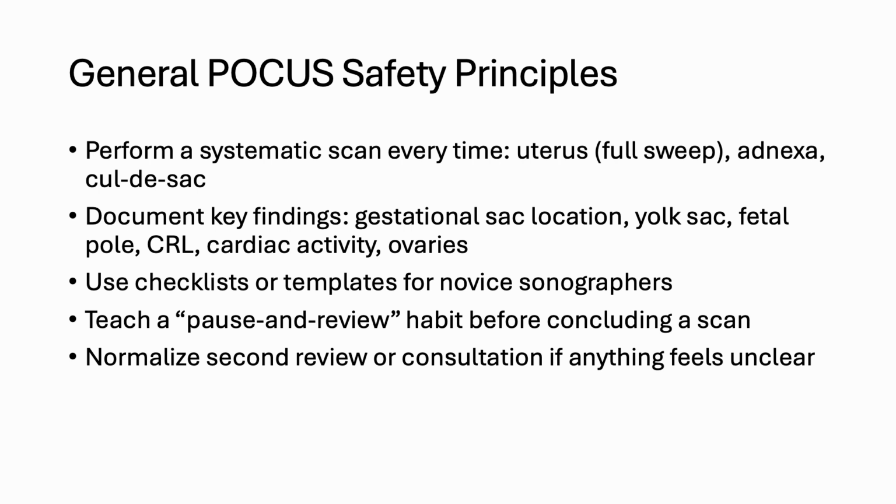Sometimes you can call them to come back if you forgot to check on something, but often they're not going to be able to come back. They're moving on. They have something else that they're doing. And so make sure you pause and you think, have I done everything? Did I get everything I needed? And then normalize the second review or consultation. So don't feel bad to get another person to check, to get a second opinion, to send her to an MFM or your consulting OB-GYN if you have concerns.